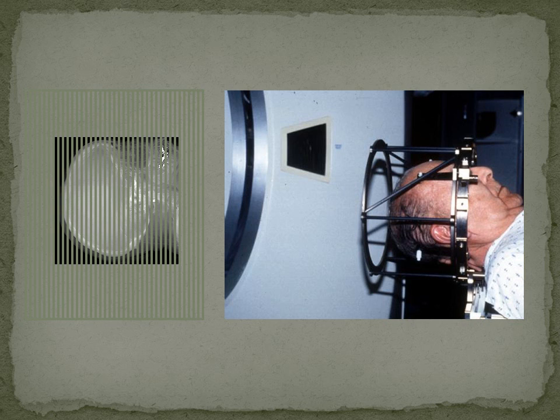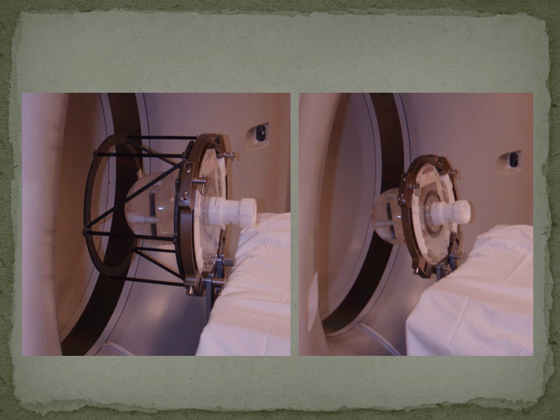And what you assume is that the CT slices are going straight up and down, the patient is square to the scanner. That's kind of a basic assumption, that the scanner has zero gantry tilt, that the patient is square to the scanner. In reality, though, when you actually go down there and you look, it's very, very difficult to get the patient truly square to the scanner. And there are two skews that you could have. One is shown here. The scanner is straight, but the patient pushes on the bracket.